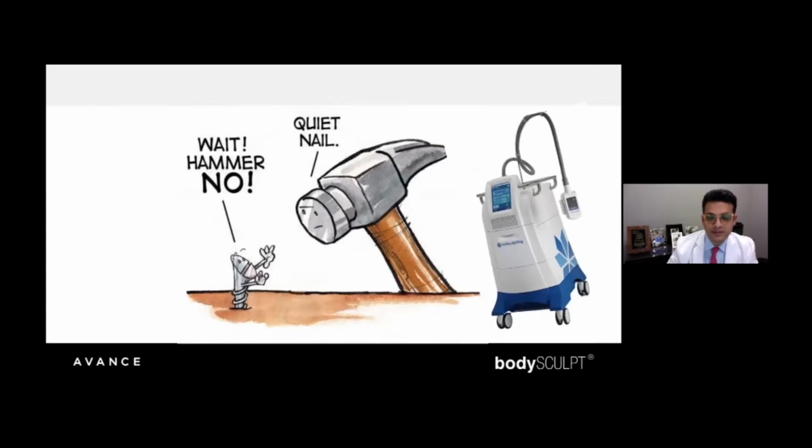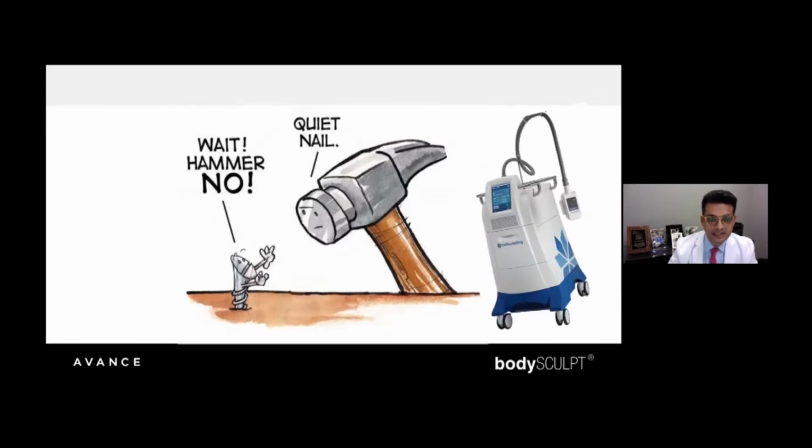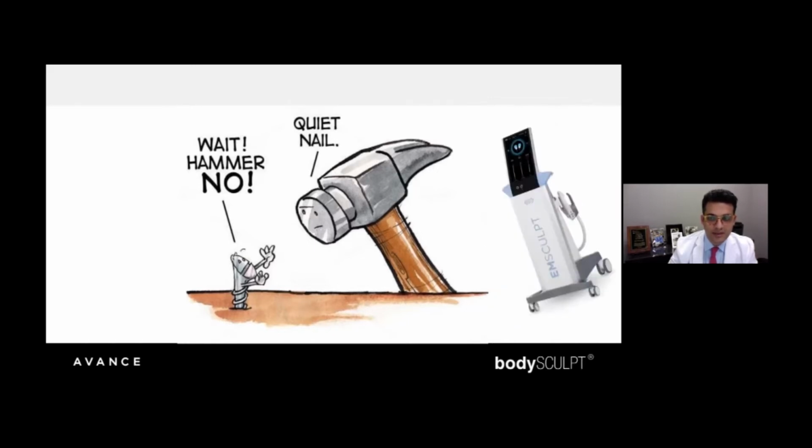So if you look at CoolSculpting, for example, if you have a patient that comes in desiring non-invasive body contouring, and they have a little bit of skin laxity, let's say they're a 40-year-old patient with 2 children, you may try to use your CoolSculpting device. And what you may find is that it may reduce a little bit of the fat, but it will do nothing for the skin contraction. And in fact, it may make the patient worse because when you lose volume, your skin laxity appears more significant. So that may get you into some issues in terms of unhappy patients.